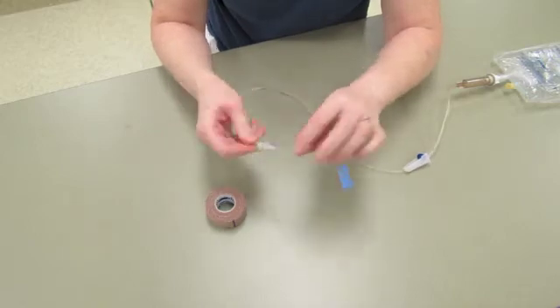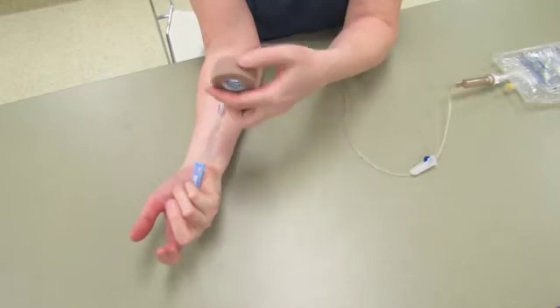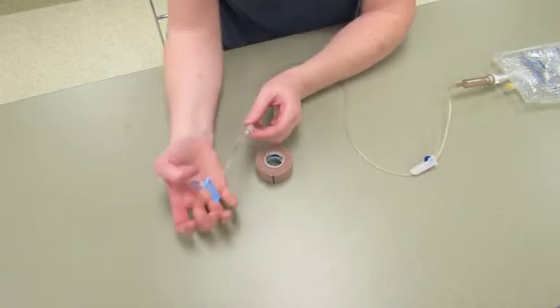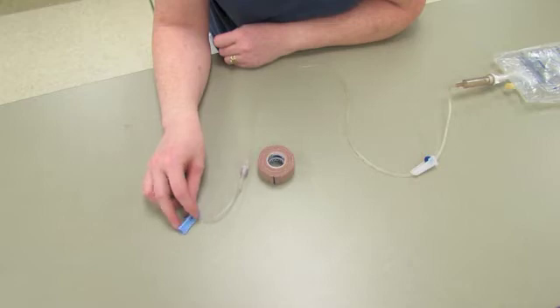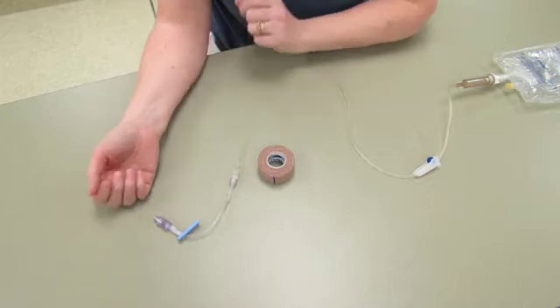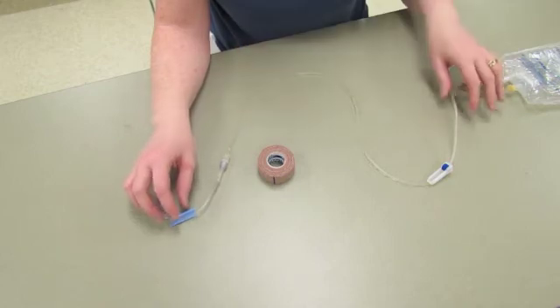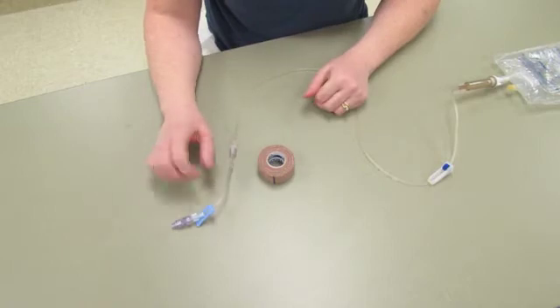After we have it connected together, we attach it to the mannequin with Coban wrap. We just wrap it around the mannequin's arm. Now this would also be a really useful method to help make the realism of standardized patients safe for the standardized patient, because again, you wouldn't be sticking them with needles, and you could give them any solution, even incorrect ones, without it actually going into the person. So let me show you how it looks on one of our mannequins.